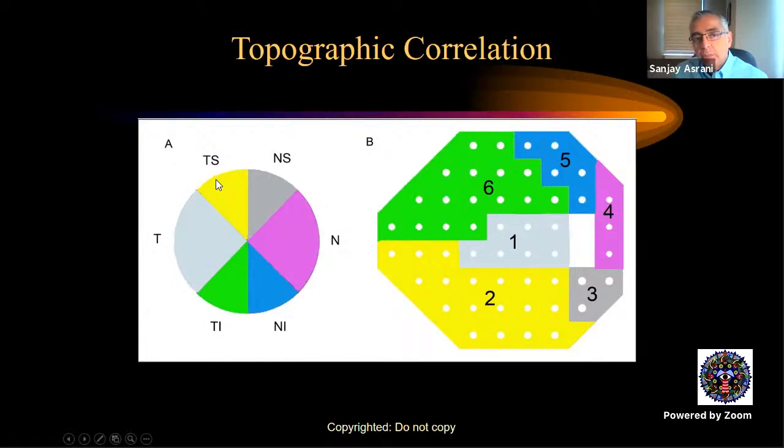The superotemporal aspect of the optic nerve corresponds to a field loss right down here in sector 2, inferotemporal up here, the gray, that is the temporal in area 1, nasal in area 4, and of course 5 and 3.